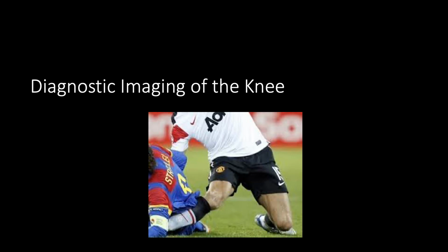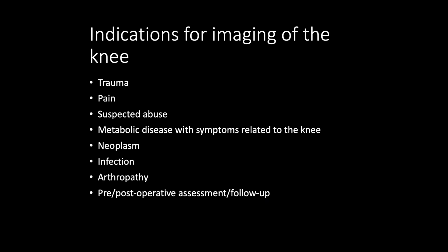Okay, we'll be looking at diagnostic imaging of the knee in this lecture. Indications for imaging of the knee include primarily pain and trauma, less commonly metabolic diseases, tumors, infections, or pre and post operative assessments will be done for imaging with the knee.